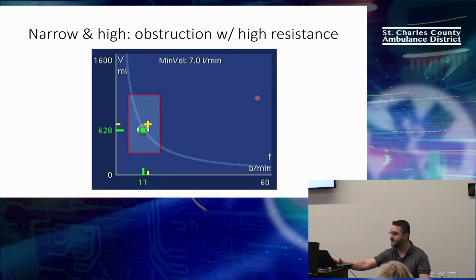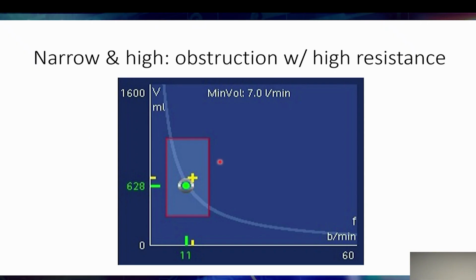Let's see what happened here. I'm sorry I gave you guys the answers. Can anyone want to guess why this happened? Why did we all of a sudden get okay high, okay low, but the rates changed? When your I to E ratio would be 1:5, 1:4. Yeah. Did you guys hear that? It's trying to match your I to E ratios where you completely exhale. So it doesn't want you to have too many breaths where you don't completely exhale, and it doesn't want you to have too few breaths where you don't ventilate at all.